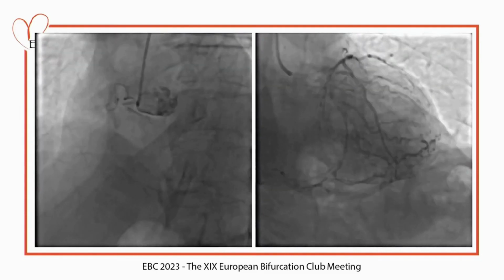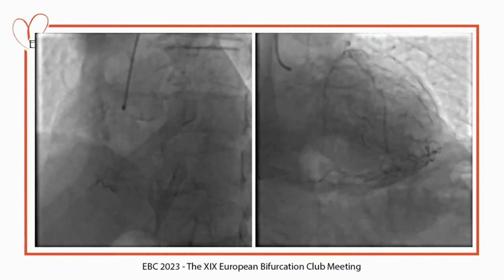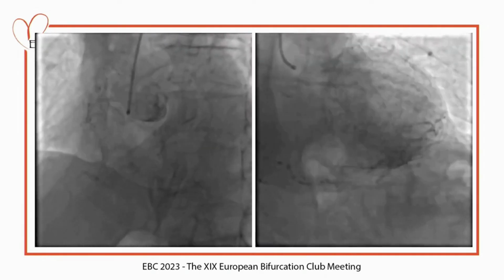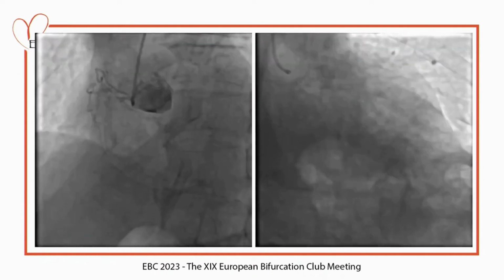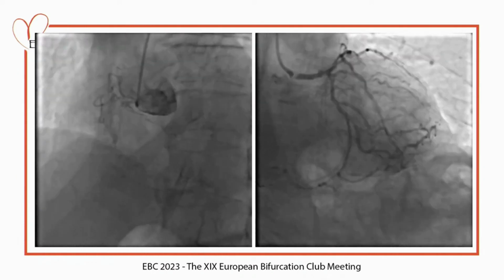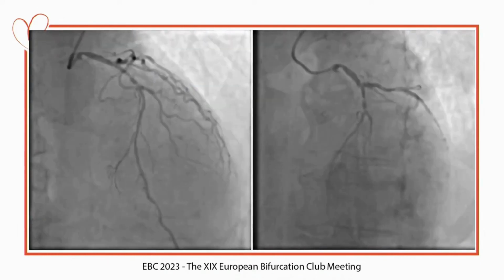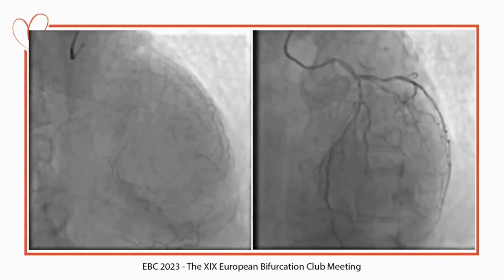In the regional hospital they performed coronary angio. The right coronary was occluded without any possibility to reopen it, which was later confirmed by an experienced CTO operator. And the bifurcation of the left main and LAD was involved, as well as the ostial left main.